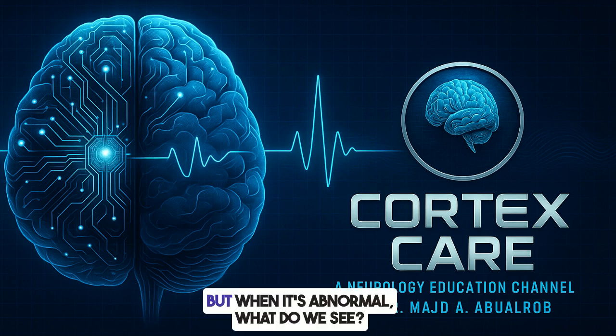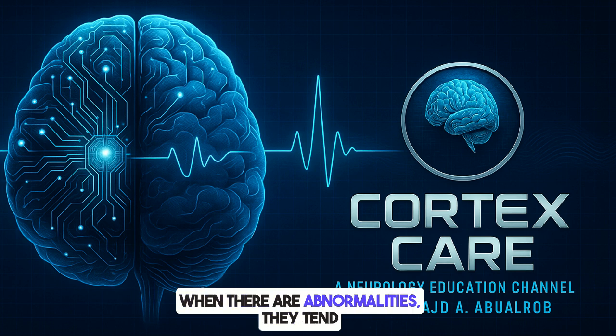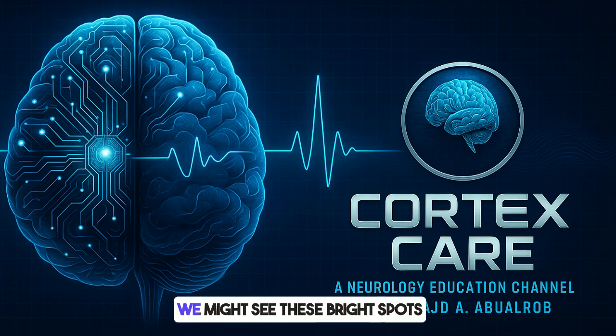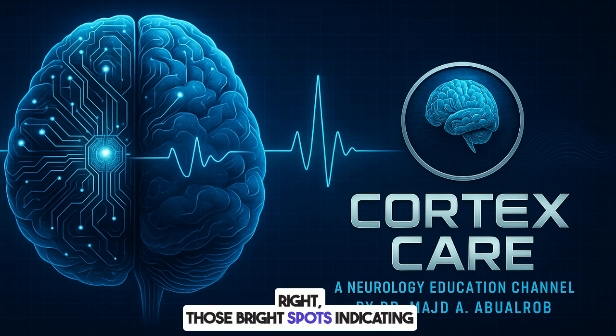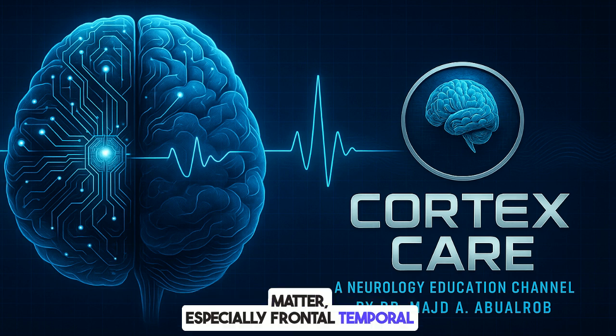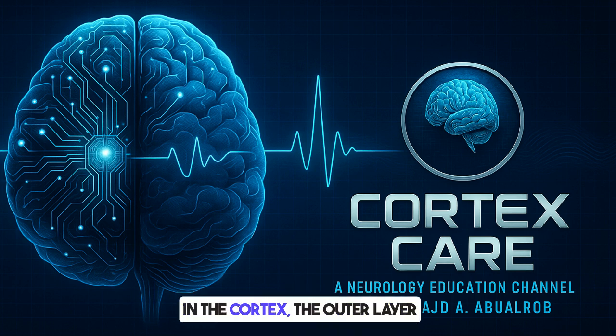But when it's abnormal, what do we see? When there are abnormalities, they tend to be pretty subtle, often nonspecific. We might see bright spots on certain MRI sequences called T2 or FLAIR hyperintensities, indicating inflammation or swelling. They might appear in the white matter, especially the frontal, temporal and parietal lobes, sometimes in the cortex, the outer layer, or deep gray matter structures, brainstem, and cerebellum too.